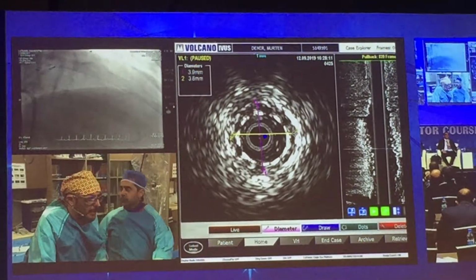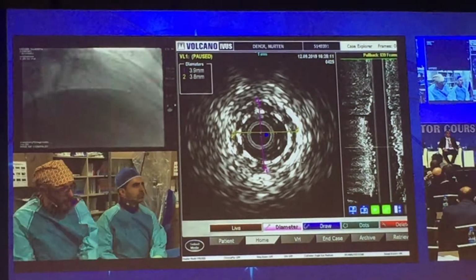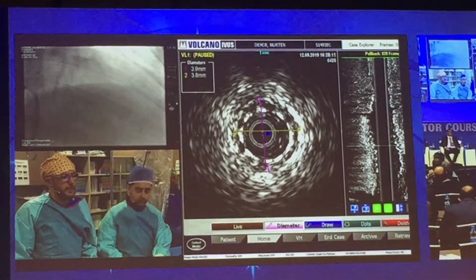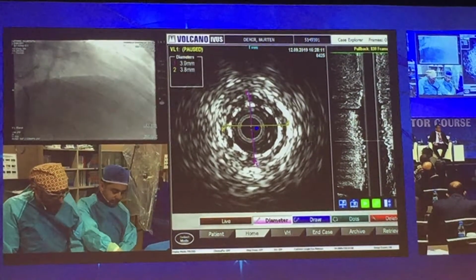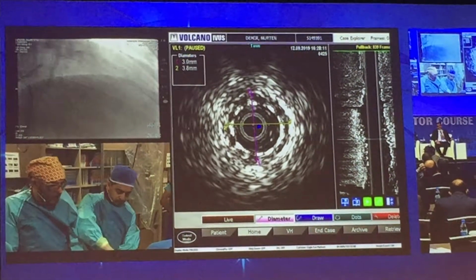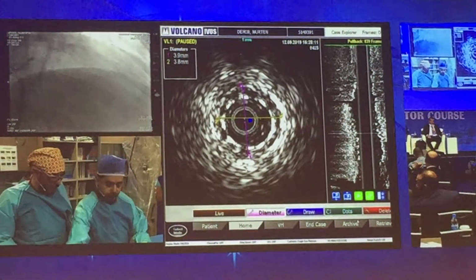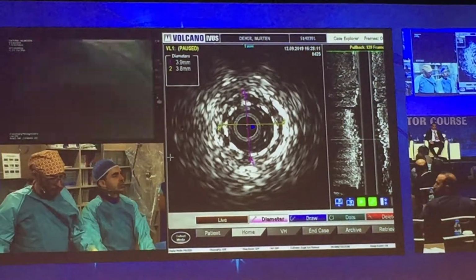4 millimeter. Yes. And what will be your stent choice? And now we are also measuring the stent size. First, we would like to measure also the stent size. Right cranial, please. Right cranial. For you again, Kürşat.